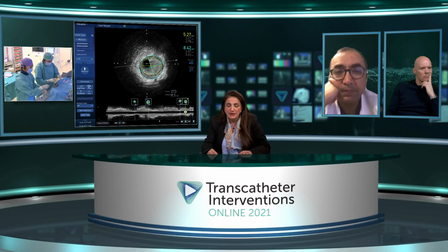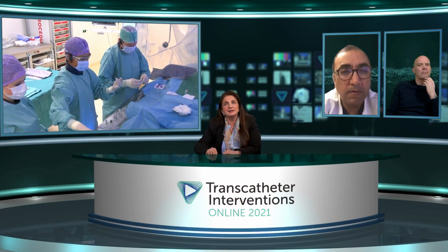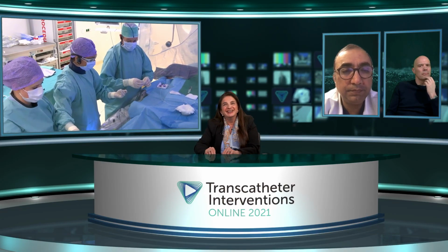No, absolutely. So as you get ready, let's turn to our panelists. Nicholas, yesterday you used IVL. Today we see orbital atherectomy. How do you choose which device in whom?